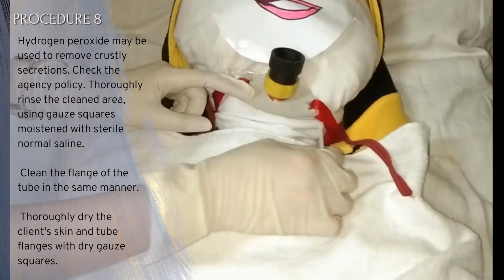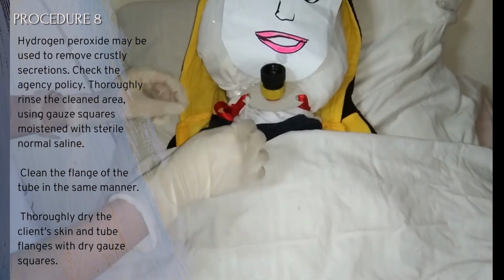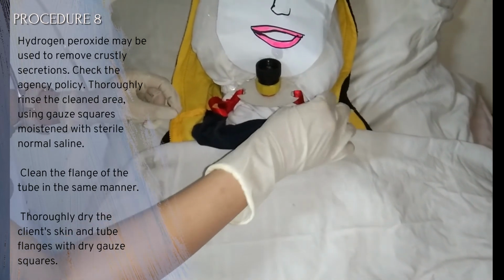Hydrogen peroxide may be used to remove crusty secretions. Check the agency policy. Thoroughly rinse the cleaned area using gauze squares moistened with sterile normal saline. Hydrogen peroxide can be irritating to the skin and inhibit healing if not thoroughly removed. Clean the flange of the tube in the same manner. Dried secretions are a good medium for bacterial growth.